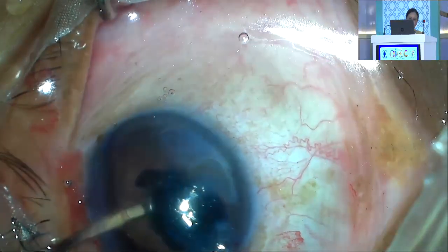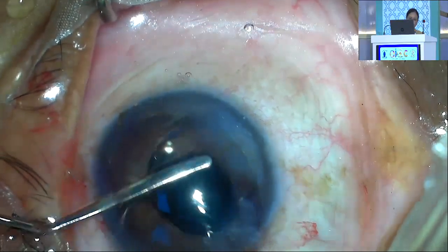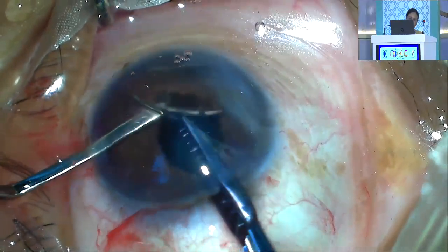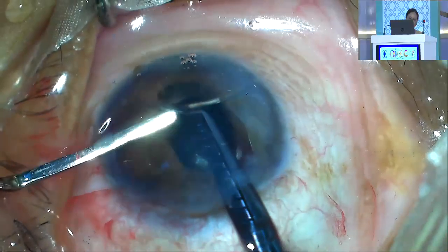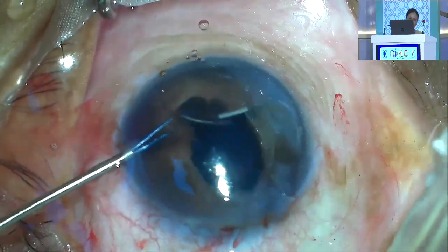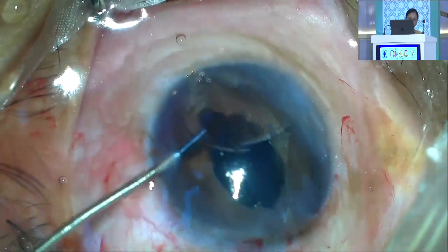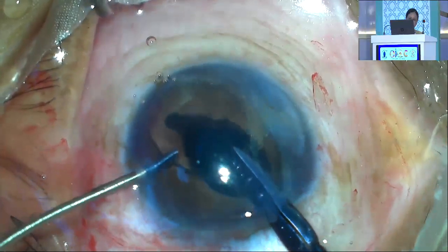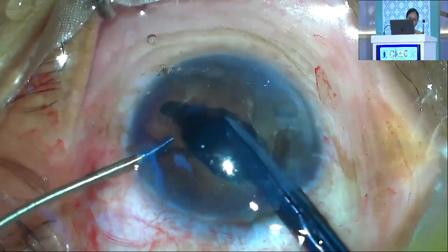The IOL is properly positioned and fixed with a spatula. The IOL cutter was introduced, but it was difficult to grasp. Now the IOL was stabilized with micro forceps from the left side port. But the cutter failed to bisect the hard rigid PMMA material even after repeated attempts.